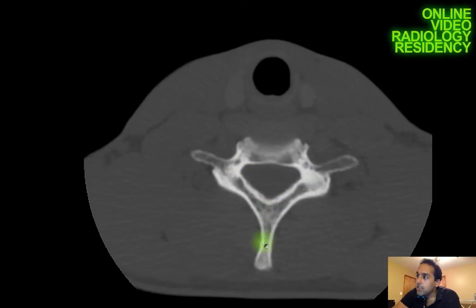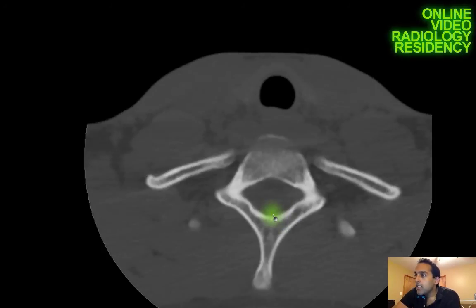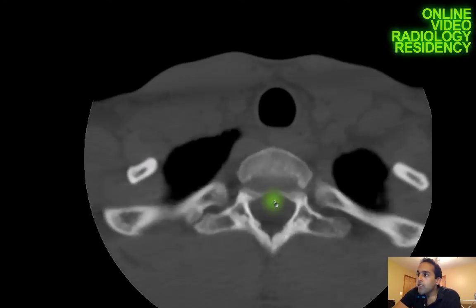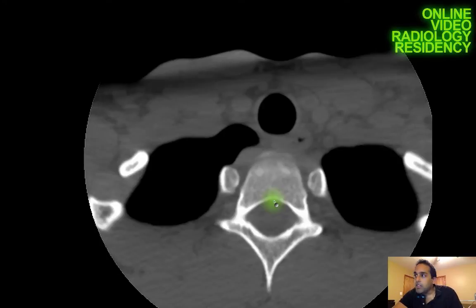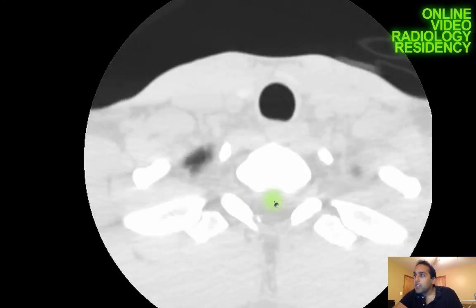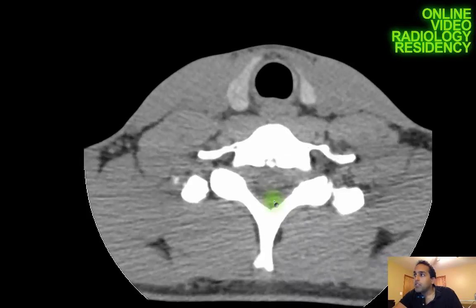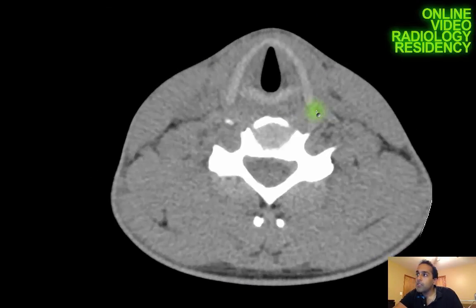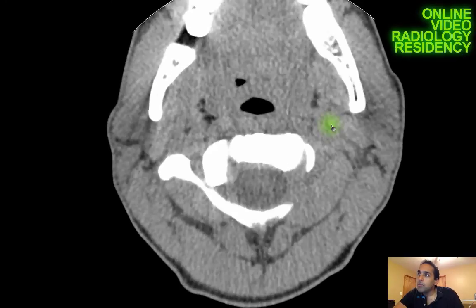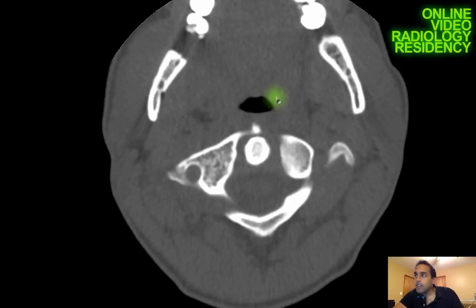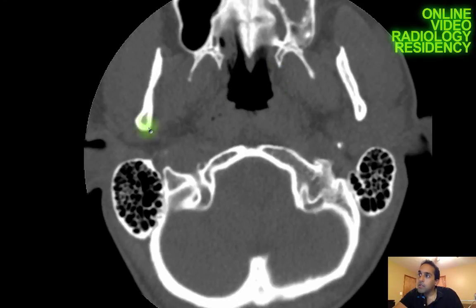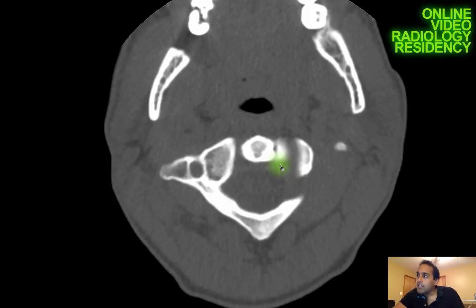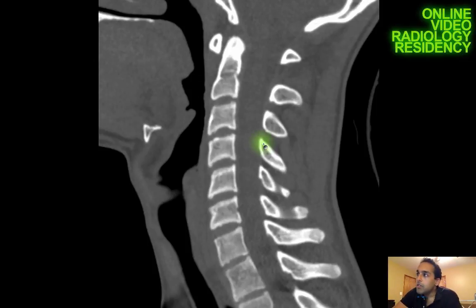I get down to the C7 level — I can tell because of its long spinous process — and below that I'm in the thoracic spine, confirmed by rib articulation. Once done with the cervical spine, I look at other tissues: the lungs, soft tissues including the thyroid, checking the neck for any gross asymmetry, and any other bones visualized that haven't been seen on other studies.